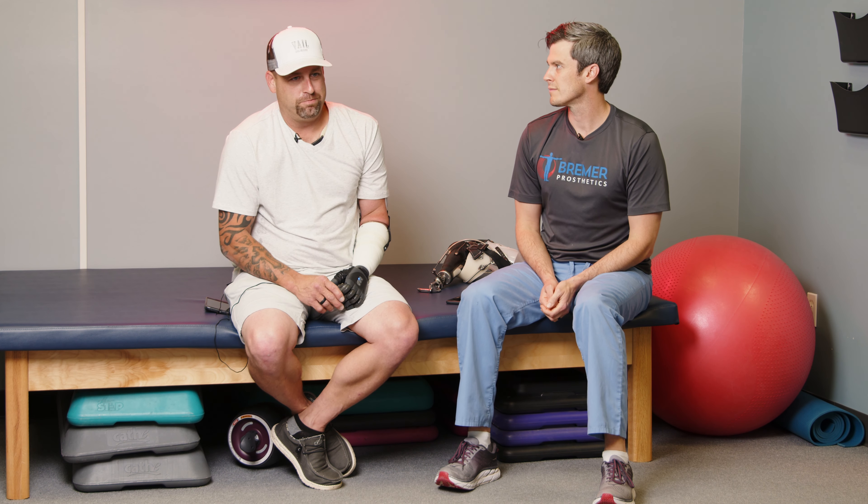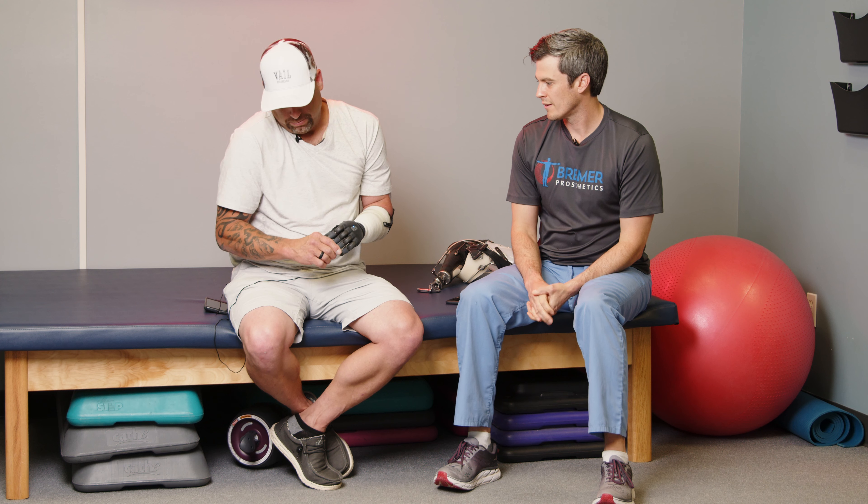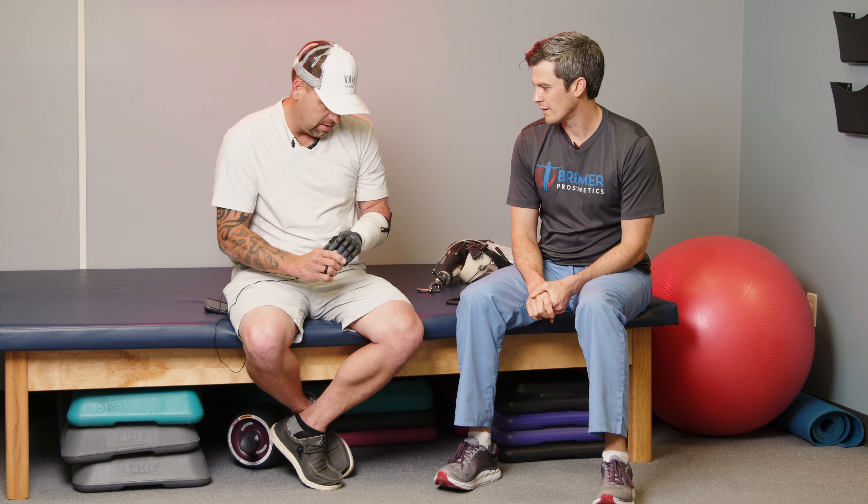My very first one that looked like a hand was probably like 12 pounds. It was really heavy. It had a silicone sleeve on it, but looking back at it now — wow. Pretty much they just weren't really usable. My hook, that body powered hook, I can do everything with it. A lot of times trying to adjust to something like this is more frustrating than it was actually worth, but having all the fingers is what enticed me. And it seems to be great. I want to put it to the test.